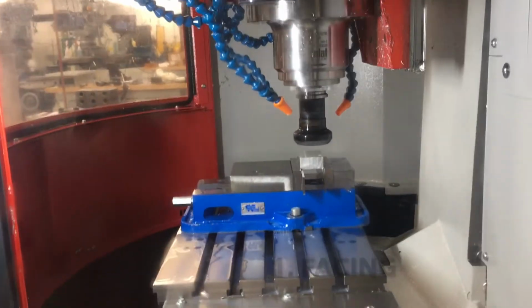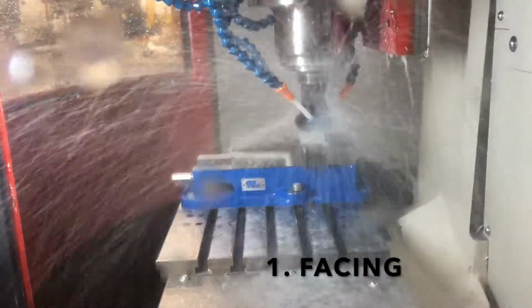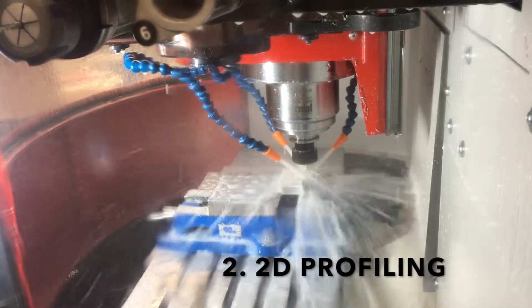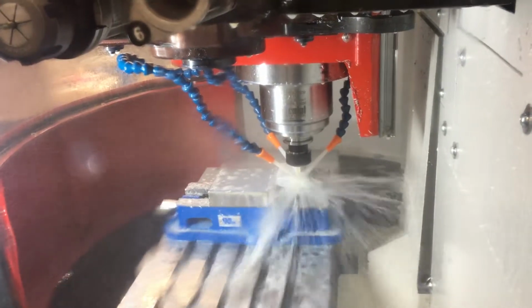Number 1. A facing mill is used to shave the stock down to where the top of the part will be. Number 2. An end mill is used to cut out a 2D curved part outline.